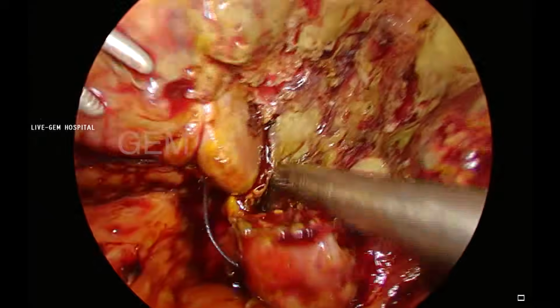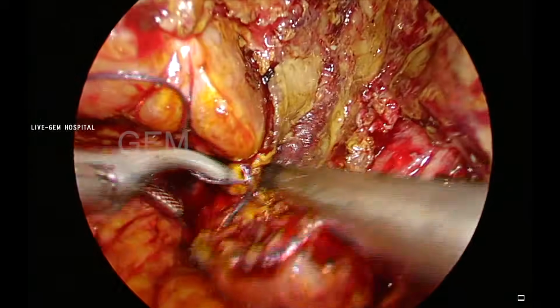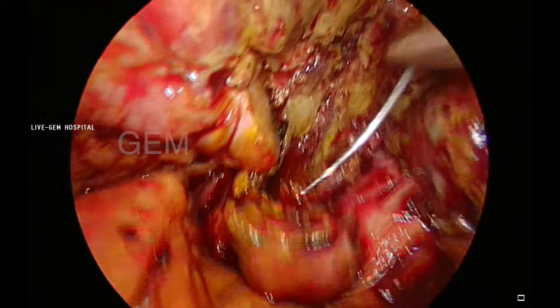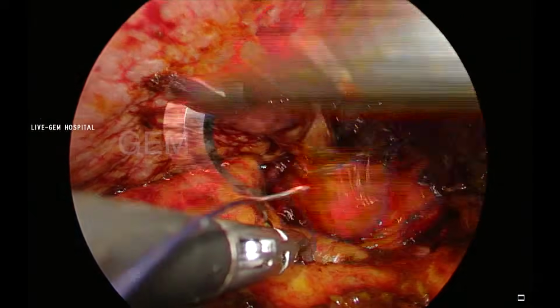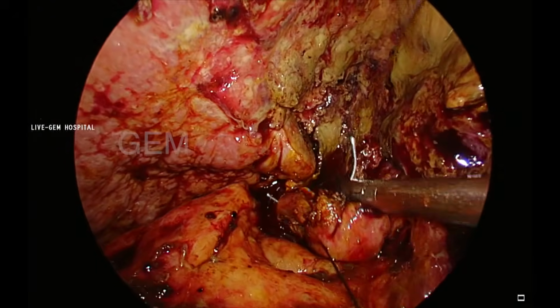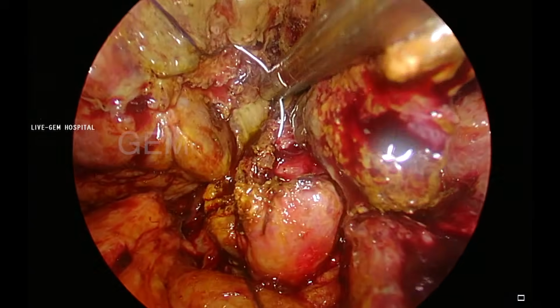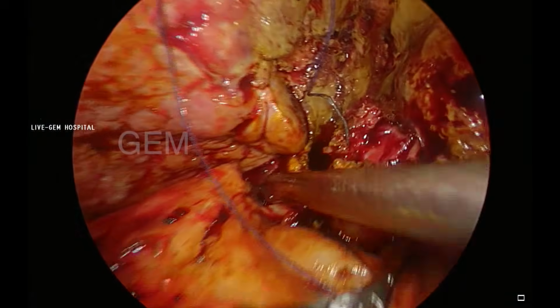Once you remove the mucosa, then you need not worry about postoperative collection in this small pouch. Mucosa is the culprit. If you remove the mucosa, then it will not enlarge postoperatively. And now you can see the very clear anatomy. CBD is very clearly seen, and this is the thickened portion of the anterior wall. It looks a little big. Now you can see the bile is coming clearly. That is bile.